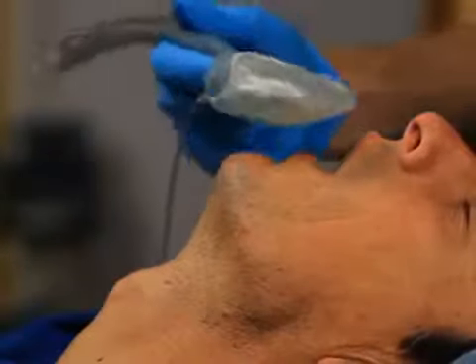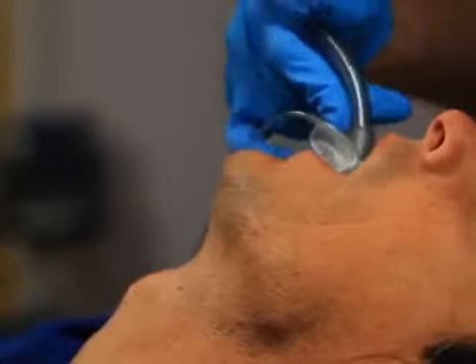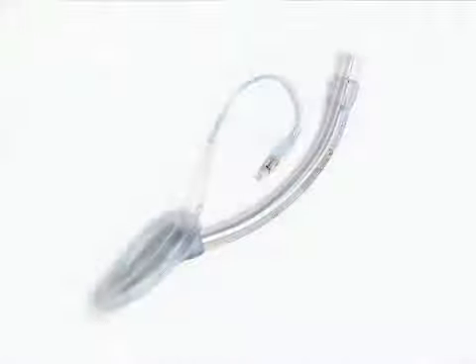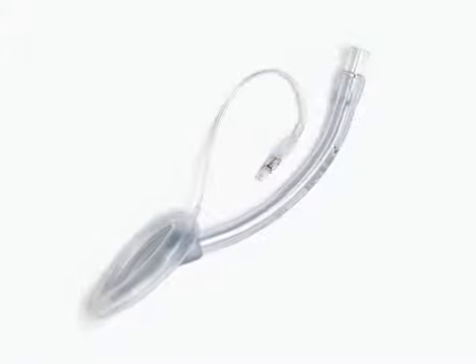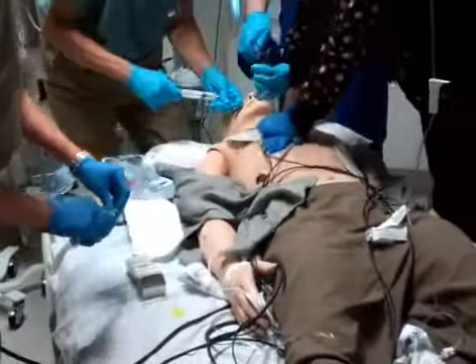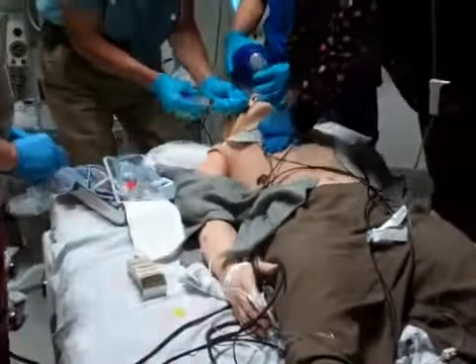This video will demonstrate the placement of the Laryngeal Mask Airway, or LMA, as an emergency airway device in patients experiencing a cardiopulmonary arrest. The goal is to provide familiarity with and instruction in its use so that a clinician will be comfortable using this device to provide effective ventilation for patients in cardiopulmonary arrest.